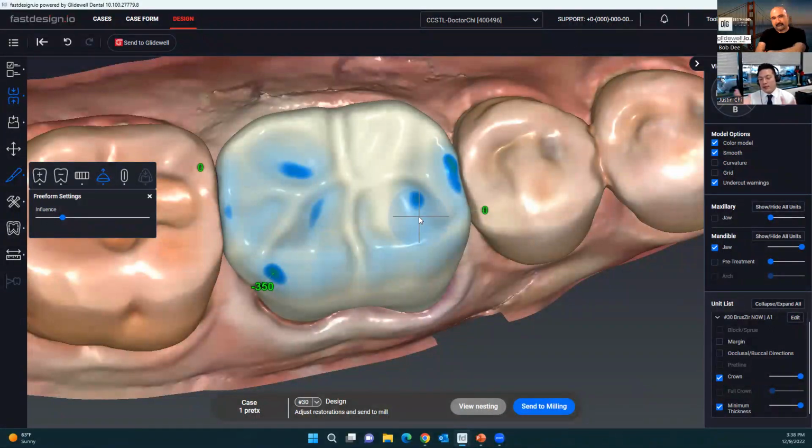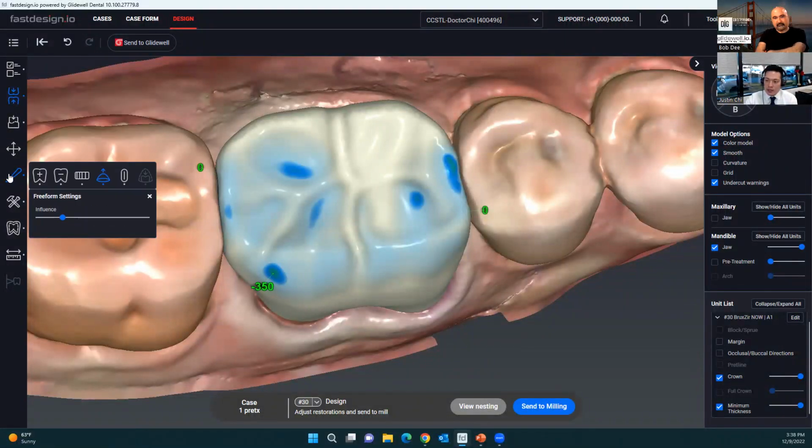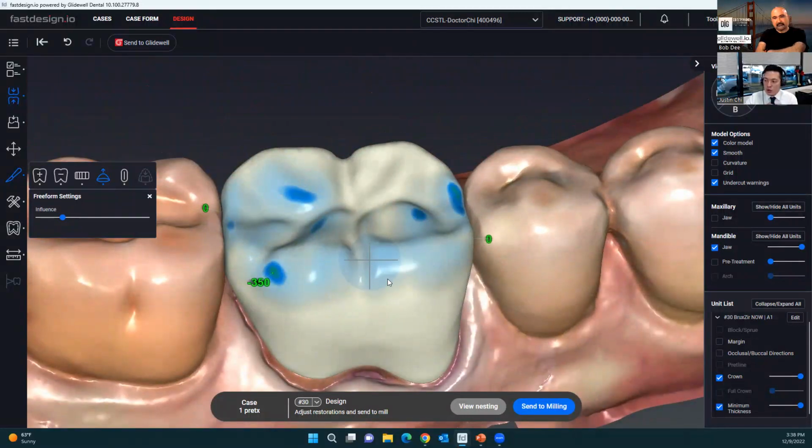So sometimes the aesthetics, or most times aesthetics, are very subjective, and you may look at this crown and may want to change a cusp position, contour, embrasure position, marginal ridge height or position. And so just to show you some of those tools that Bob was alluding to, on this left-hand side, we have this section called Sculpt. And you can see when I click Sculpt, so I basically went away from this context window, went to Sculpt, and you'll see there's a row of tools here, and on by default is one of my favorite tools called Freeform. And what Freeform allows you to do is really take control of literally any part of this design.